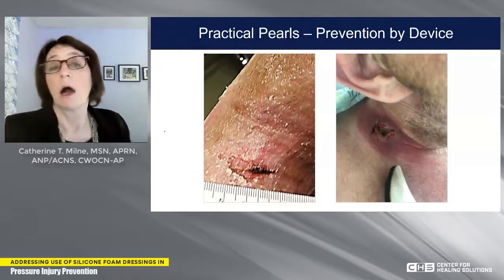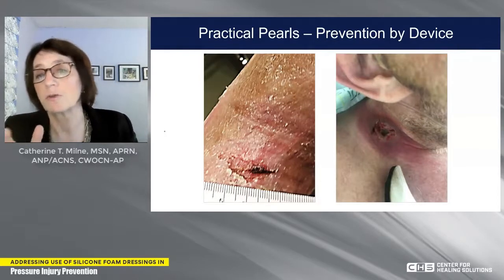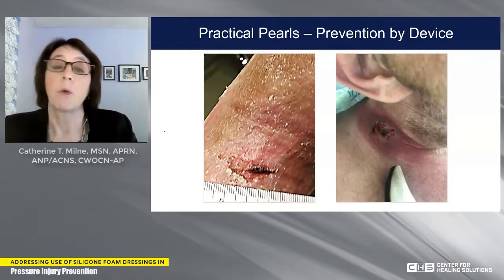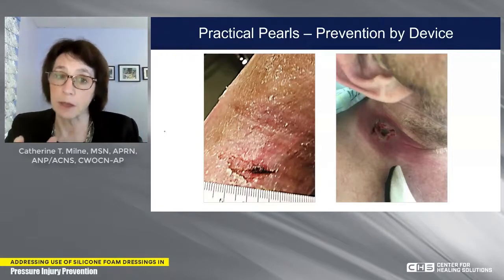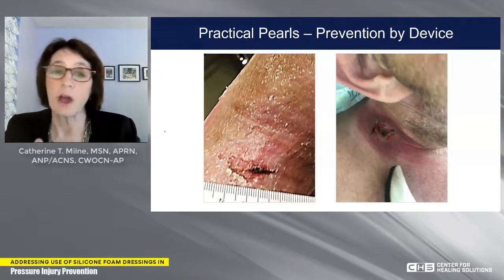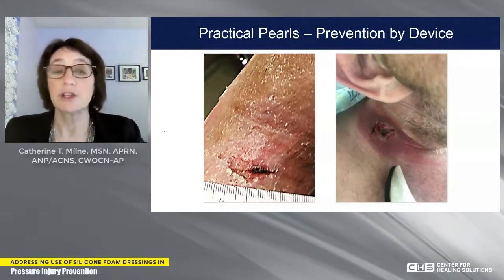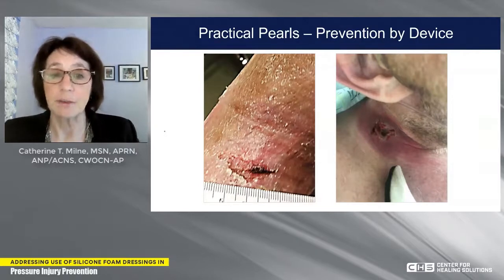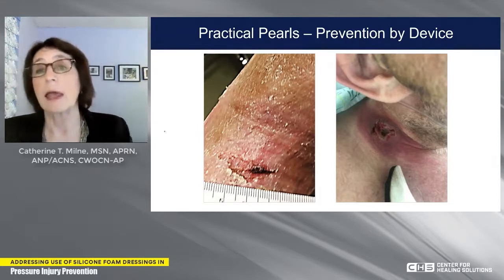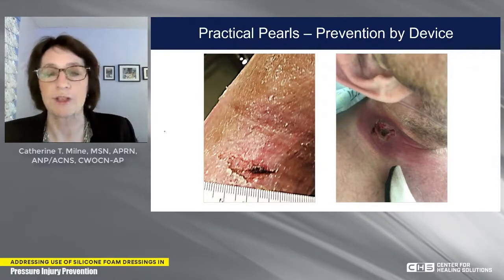What a lot of people do, where they think they're being cost effective, is use a bunch of gauze, which moves, by the way, underneath these wraps, or they'll use an abdominal pad. Again, the abdominal pad gets a little bulky. On top of that, it also moves and can bunch up, and it's really not cost effective because you're most likely changing it every single day as you're dealing with the wound. You can just use a foam dressing in place of the ABD pad. First of all, you don't have to change it every day. You can lift it up, take a look at the skin, and put it back down, and that makes it much more cost effective than using a new ABD pad every single day.